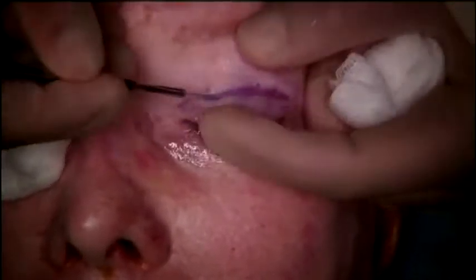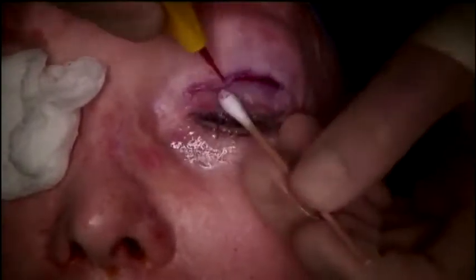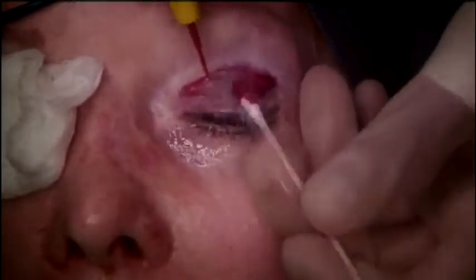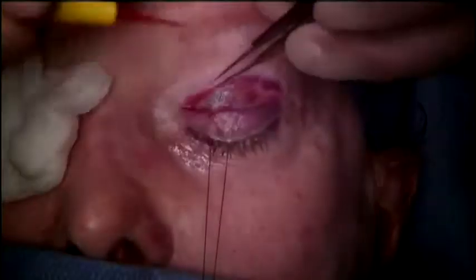A shield is placed to protect the eyeball, and a 15 blade is used to make a skin incision over the pre-placed skin markings. I typically use a Colorado tip cautery to go through the scar tissue and release the scar tissue all the way down, at least onto the orbicularis before we get to the septum. Now a 4-0 silk suture is also passed through the gray line, and that helps with traction and it stabilizes things so we can measure how much skin is going to be needed for anterior lamellar reconstruction.